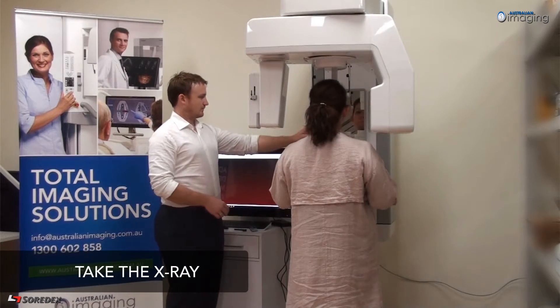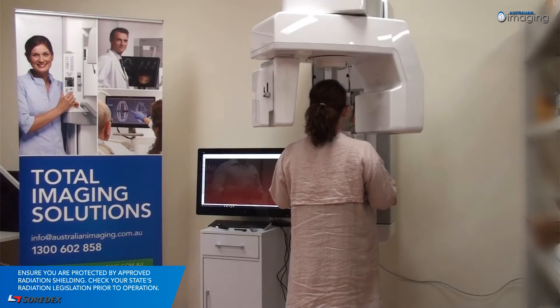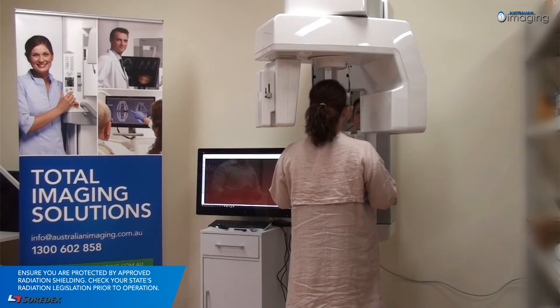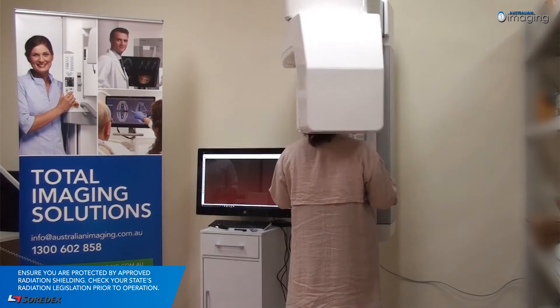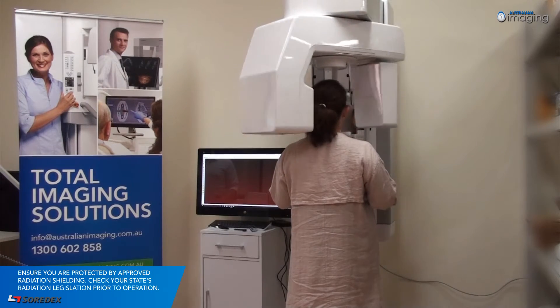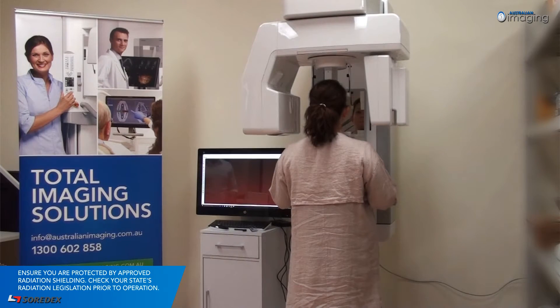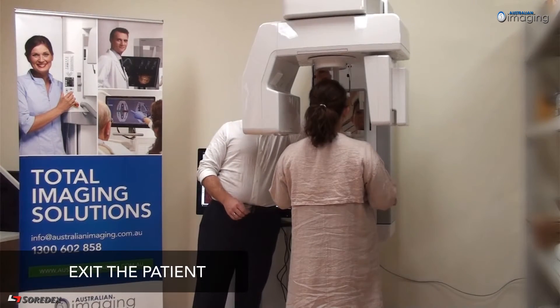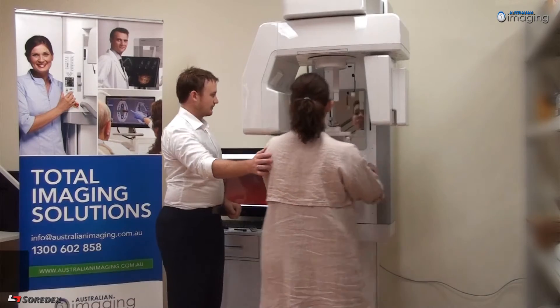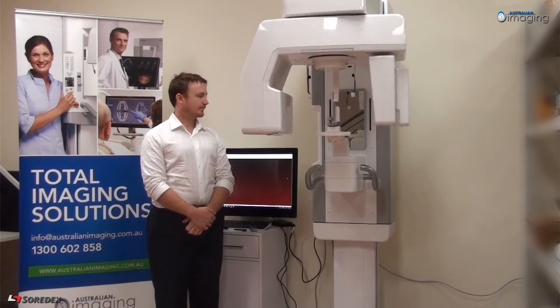Select your desired exposure level on the control panel, protect yourself from radiation, and then press and hold down on the exposure button. During the exposure, you will hear a high-pitched beeping sound and the exposure warning symbol will appear on the control panel. The image has been taken once the machine has completed one full rotation and the beeping has stopped. Your image will automatically be available for analysis in on-demand. After the exposure has been taken, the unit will pause in the patient exit position. Release the patient from the machine and then press the return button to revert back to the start position.